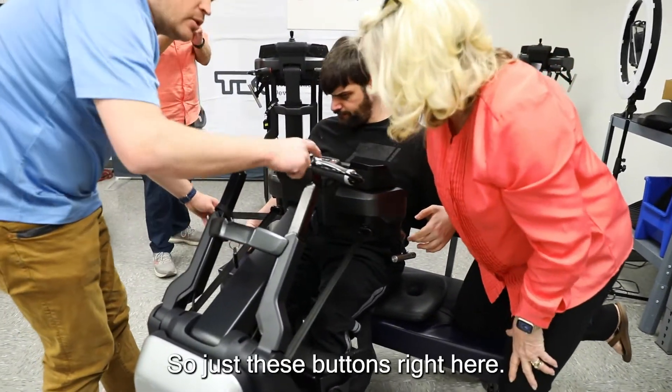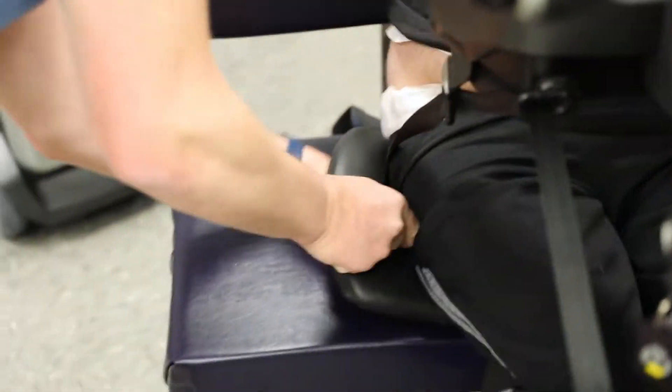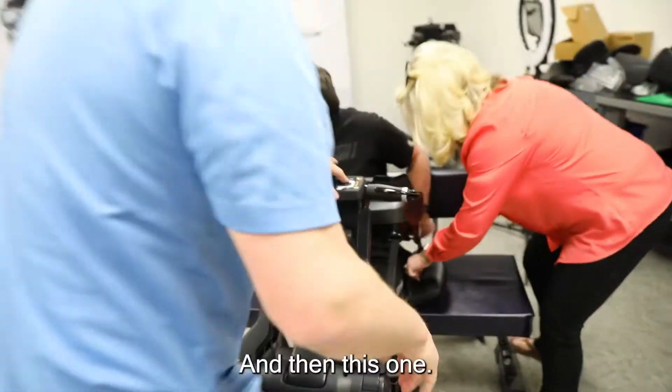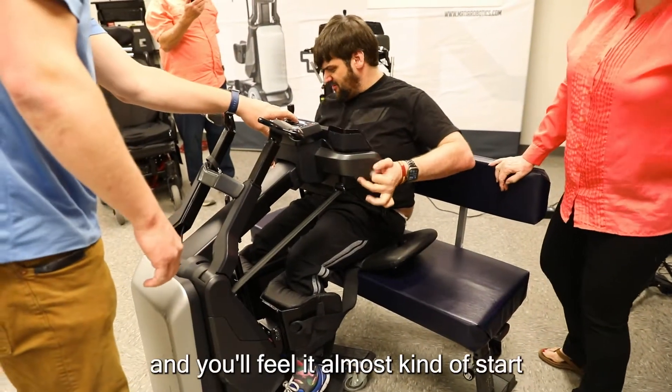Now I'm going to go ahead and loosen these belts. So what are you touching? Just these buttons right here, so I just kind of do one at a time. If you want to just shift your weight a little bit that way — perfect, all right, you're good.